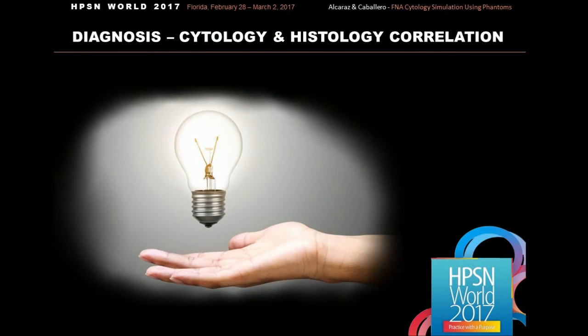After performing the technique, each case is studied under the microscope to obtain a diagnosis. This is the only way to learn pathology. There's no other way to correlate the clinical background with the histologic features.